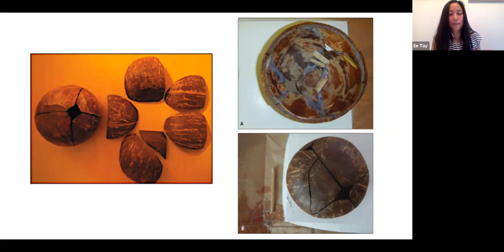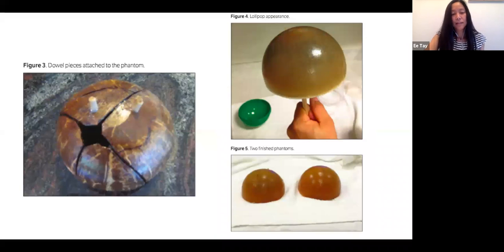You can see from the image on the left side, and on the right side is when they glued everything back together and tried to make also fracture lines. And this is what they came up with. So you need to somehow know how to ultrasound this and try to hide it in something so that people won't exactly know where to go. So they actually kind of have to find it.